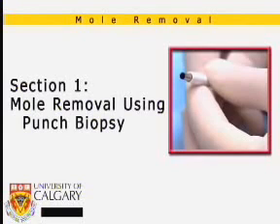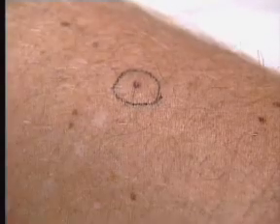This section of the video will demonstrate the proper technique for removing a mole using punch biopsy. The patient has a mole that is irregular and has changed in appearance. Identify the mole, ensuring you have patient consent.